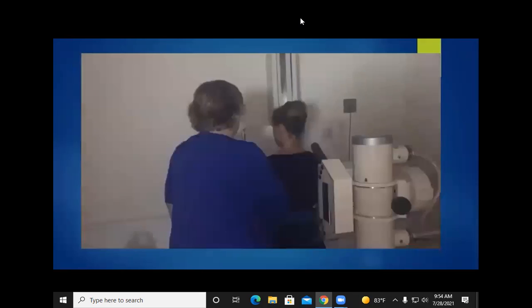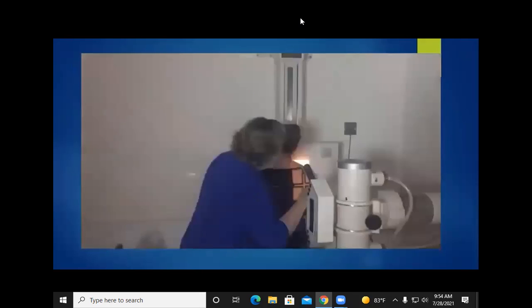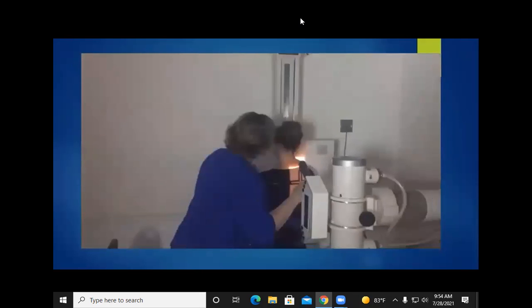She's going to show the lateral now. So that was her right arm. So her right arm's going to be touching the board. She's going to be in RAO position. The obliquity is going to depend on her, where her acromion and coracoid are going to match up the vertebral border through. And that is the lateral coming midway between vertebral border of the scapula.